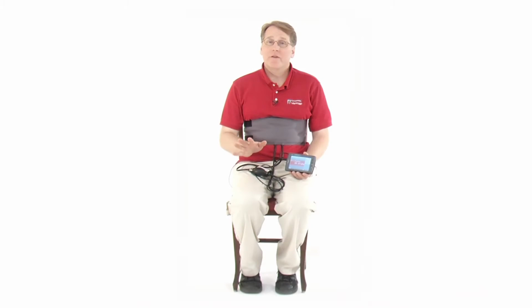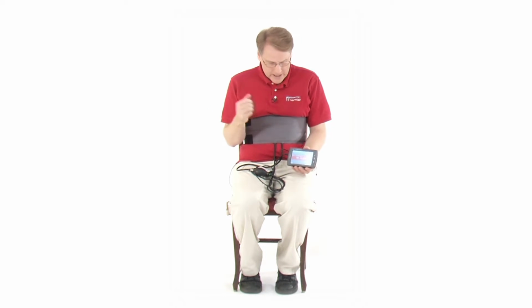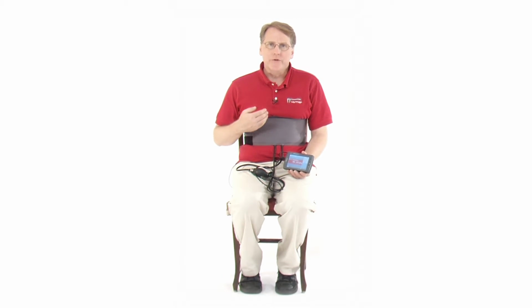It's very important to have the respiration monitor belt fit tightly across your body and be in the right position. So what we recommend is that the test subject sit down, and you could have somebody assist, which I did, to put on the cuff here. And I've got it set so it's about at the bottom of my elbow, so it crosses my diaphragm here. And what I will do is pump the cuff up using the bulb that's here.